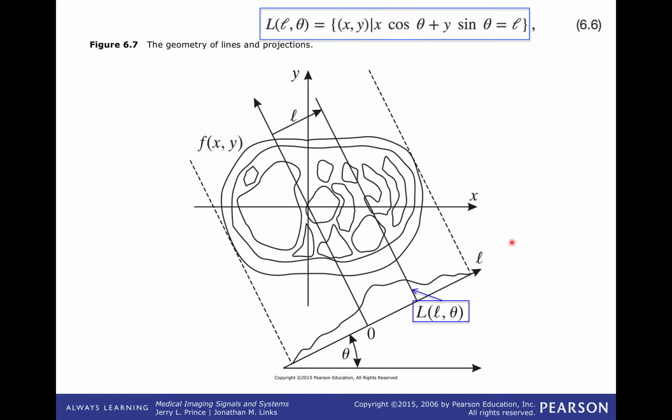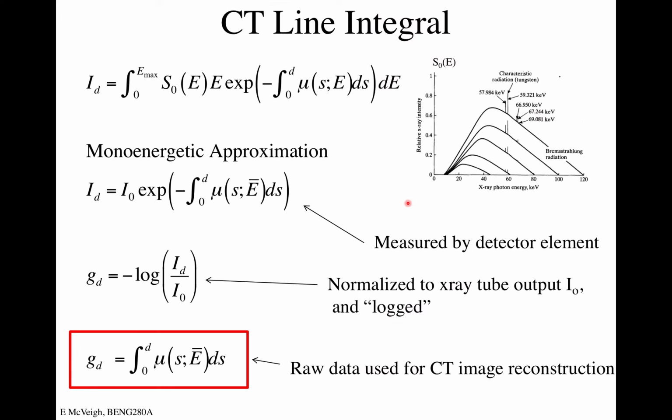Now, those of you who are thinking ahead or astute are saying, well, wait a minute, that only lays out parallel lines. And you showed us that we no longer have parallel lines. We have this fan beam thing, right? So we'll get to that.